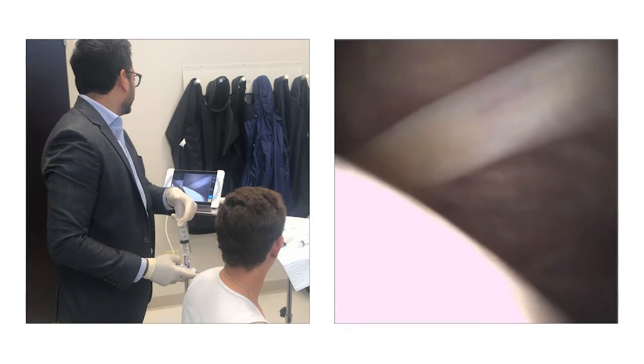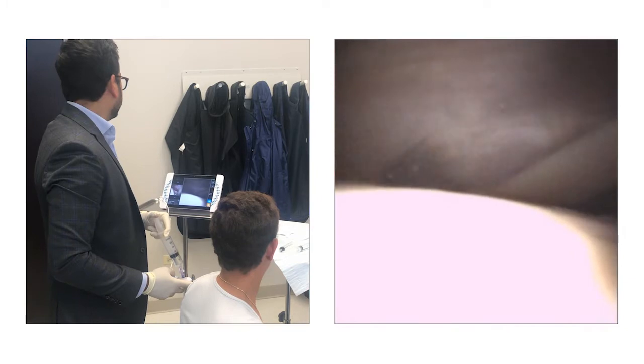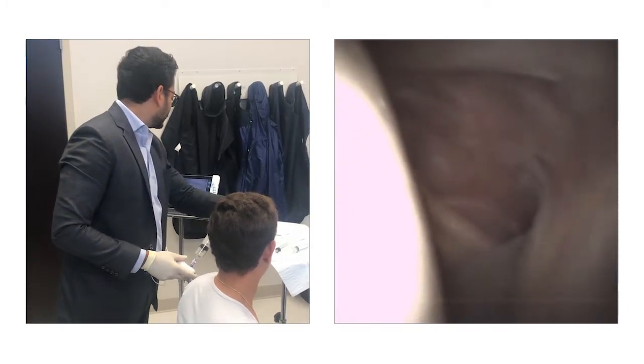Shoulder line. Pull around. See the rotator cuff above. But no funny colors, so that's good.